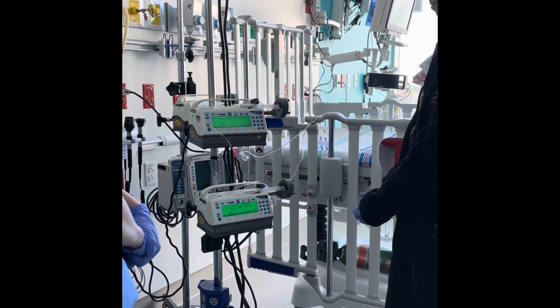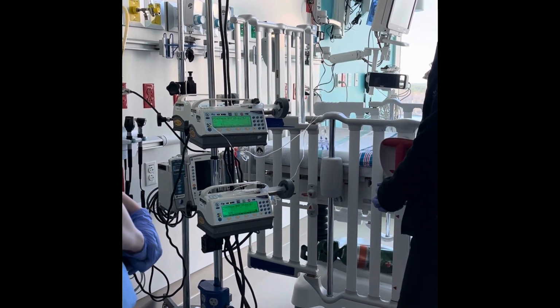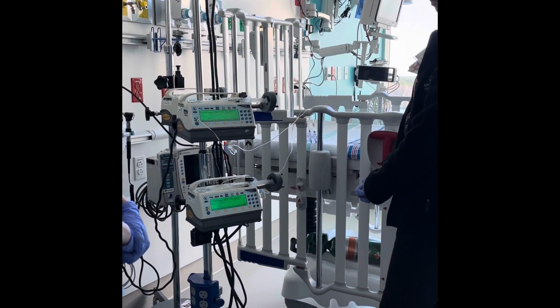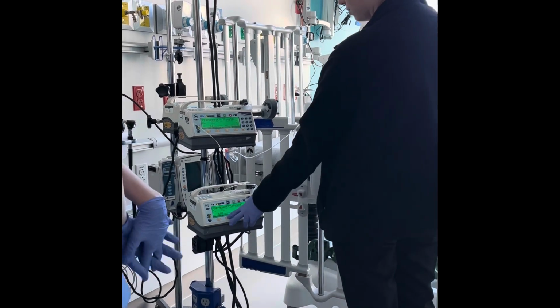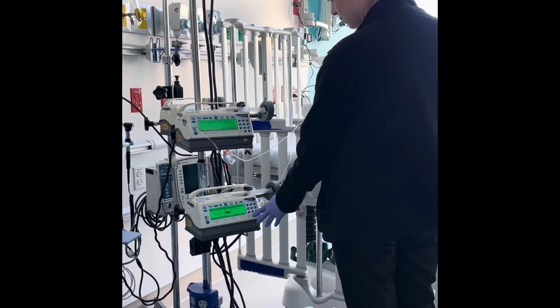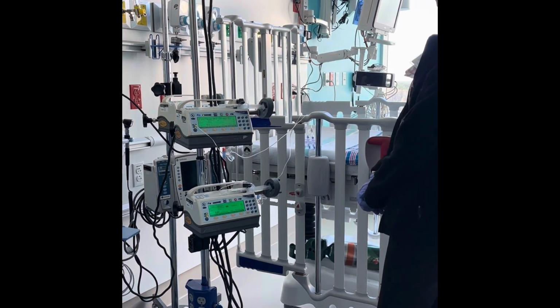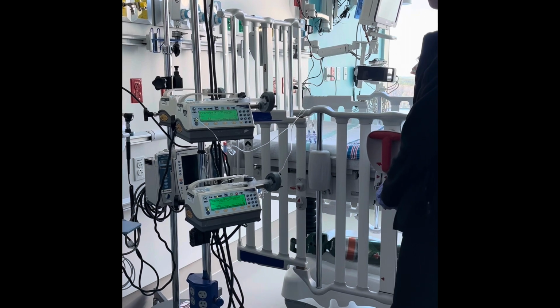During this process, you're monitoring your vital signs and making sure that your blood pressure is not changing by more than 5 to 10 millimeters of mercury. Once your old infusion is completely off, discard your syringe, remove it from the manifold, and make sure that you are labeling your new syringe per policy.